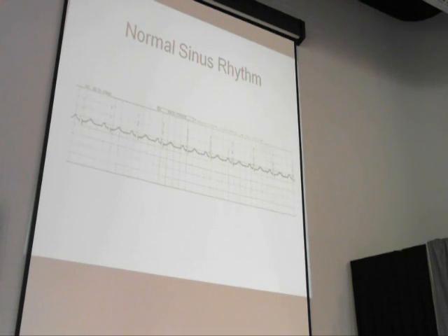So that's why we look at monitors. That's why we have to assess and label and find out what is wrong with our patients electrically, so we can fix that and get the desired mechanical response that we want.